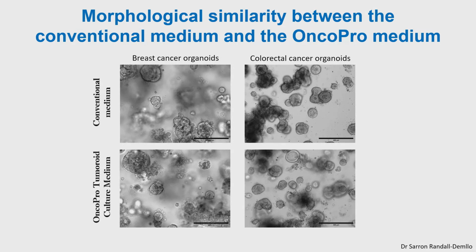Given the previous presentation by Colin, I would say very likely. Can we maintain similar cell populations between the two media? It's something that we'll be looking at by performing, of course, RNA sequencing, but also histological characterization. But I believe that this medium, at this stage, is looking very, very promising to sustain the growth of the organoids.